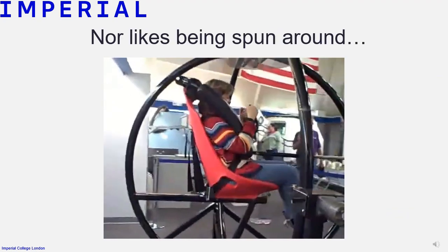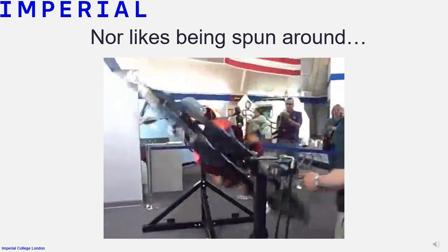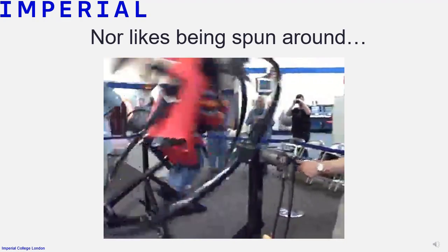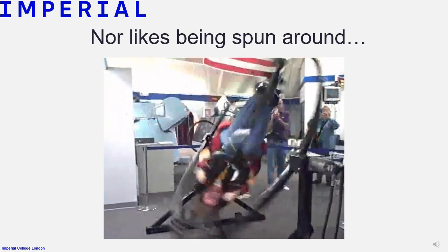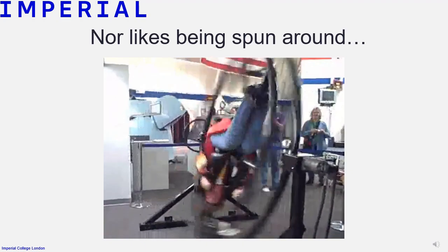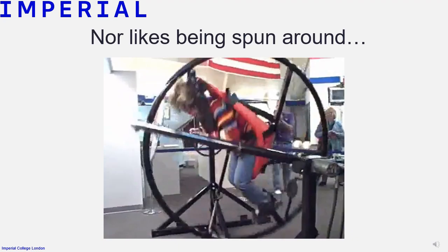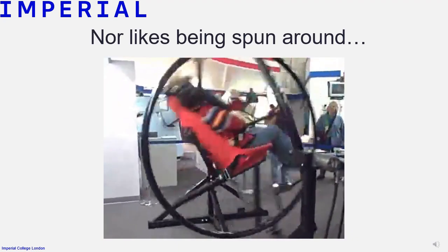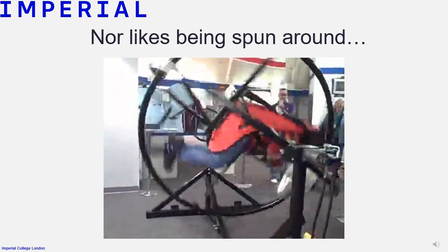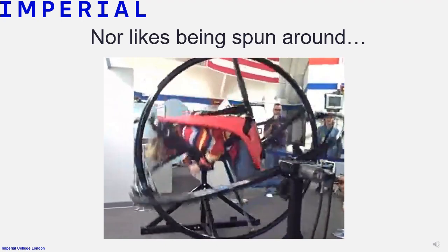We know that magic angle spinning works well and can boost signal in NMR. It was suggested that we could try something similar with humans. What could happen if we spun them into different positions and then scanned them? So we could develop a kind of magic angle spinning in vivo. But what would it take to actually build an MR scanner big enough so that a human could spin around inside it? NASA had already developed a gyroscope which successfully spins a person. That was the first suggestion, and I know how frustrating it can be when a patient moves after you've been scanning them for a period of time.